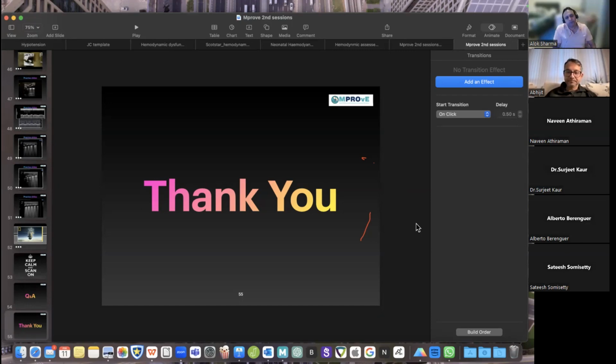Just to clarify, so the ideal color scale is 3 to 5. Is that okay? Thank you. Yeah. So what happens here is, why I said the lower color scale is important, because sometimes when you are scanning, you might see a lot of speckle and it becomes difficult to differentiate, oh, am I seeing speckle or am I actually seeing a vessel?